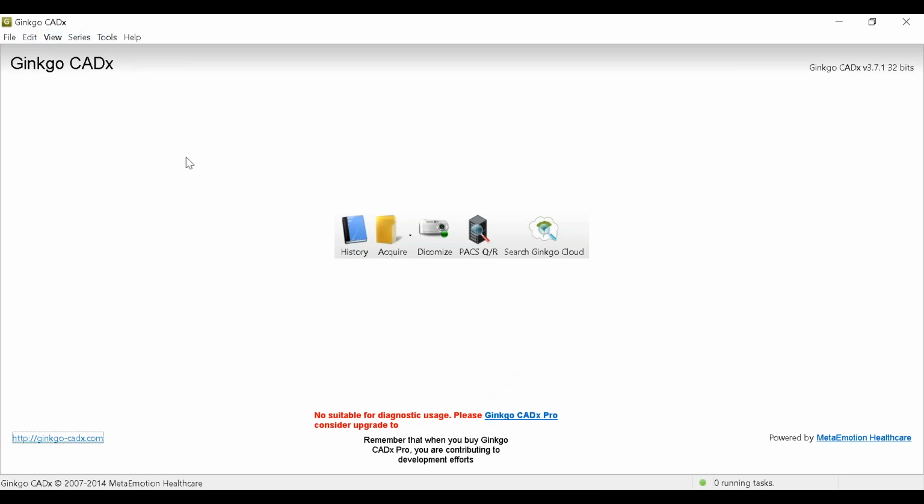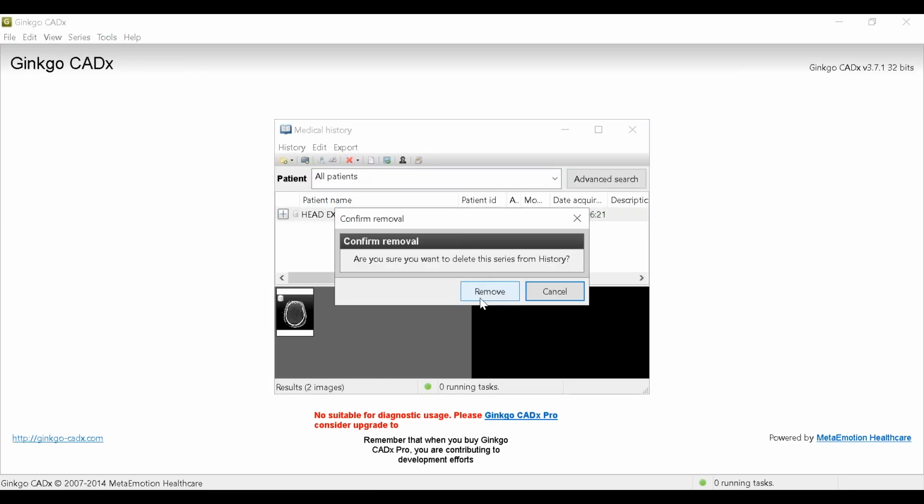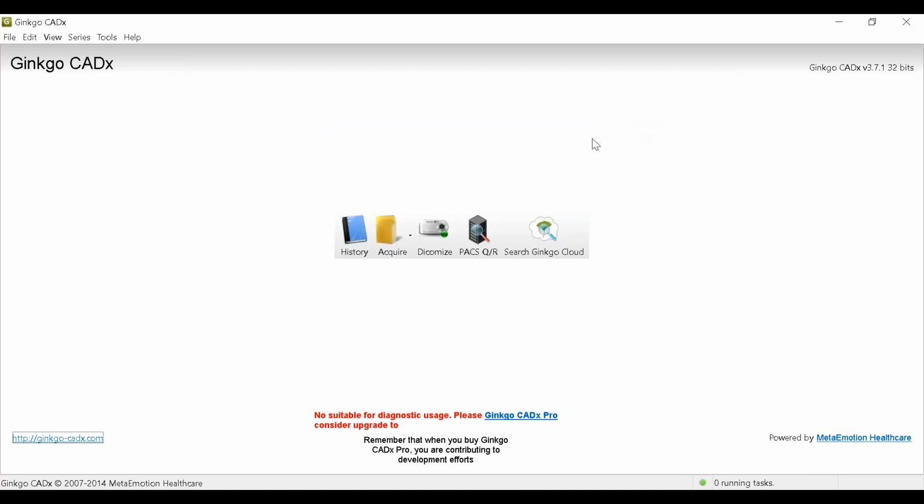So Ginkgo views images. Here's an image. I'm going to go ahead and remove this image from the database. That was my test from last night, by the way. I've deleted all of the images that we had in the Ginkgo CADX. So what I'm going to do here is show you how to set up Ginkgo. You go to Tools, and you go to Settings. Notice here you have logs. That's just like the server. Well, I got a log right here, right? So you can see both from the client end and from the server end how the communications go.